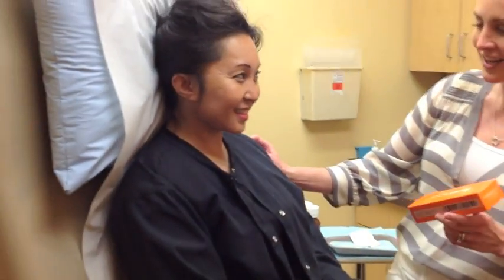Hi, this is Dr. Jennifer Reichel at Pacific Dermatology and Cosmetic Center, and we're going to do some under eye injections with a filler called Belotero. It's a hyaluronic acid filler, really nice for under the eyes. It flows very smoothly. This is Reichel, who we're going to treat, and if you want to bring the camera in close and take a look at her under eyes.